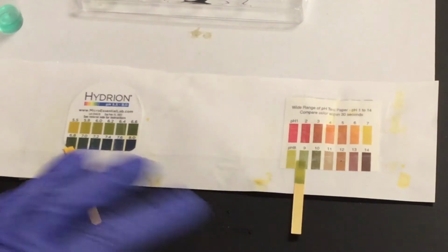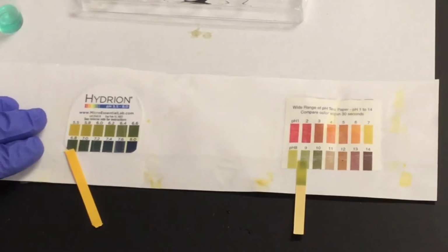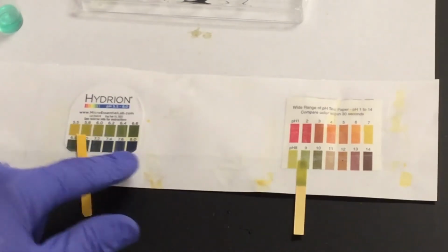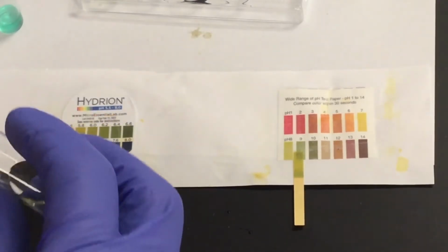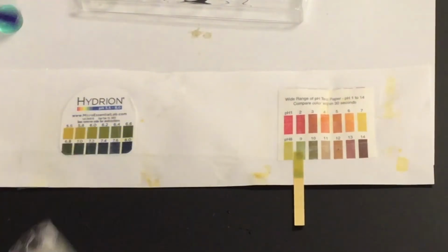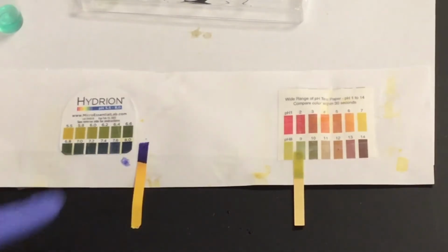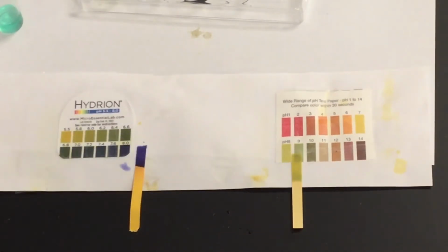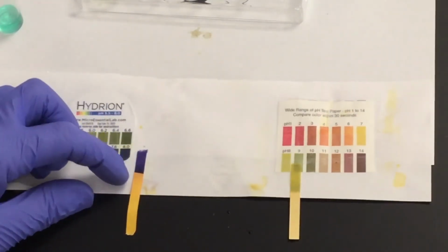So I'd probably go about 8.5, maybe a 9 on that, which means that if we're looking at our other chart, it should be way off the edge here. So it definitely should turn purple because it should be pretty close to it on both. And it does turn more purple. So I would say it's actually way over here more because this is your blue. Being purple, I would go more probably about a 9 on that one as well. So your color, your clarity, your pH is done.